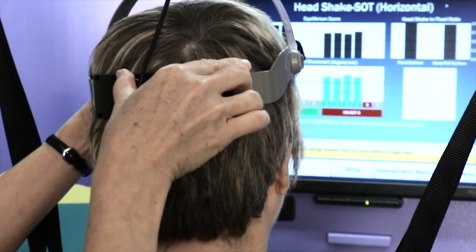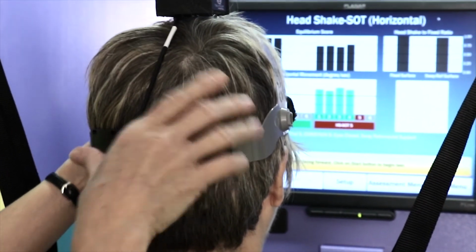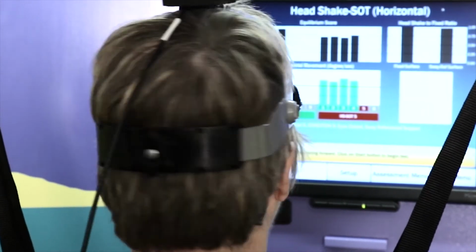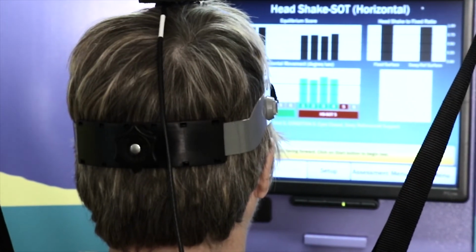All right. Try to get it centered, and then tighten it up so it won't move. Will you shake your head a few times? Make sure that's steady on her head.